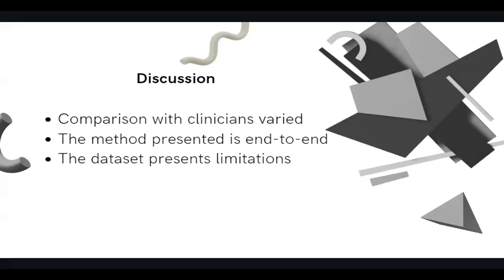The data set presented is very limited. Like I said before, the data set is really small, and so we don't know how effective BabyNet would be with a bigger data set. And the population is very specific. They didn't have varying races in the data set. So they're not really sure how that would apply to, say, the United States, which has varying races, ethnicities, and nationalities.